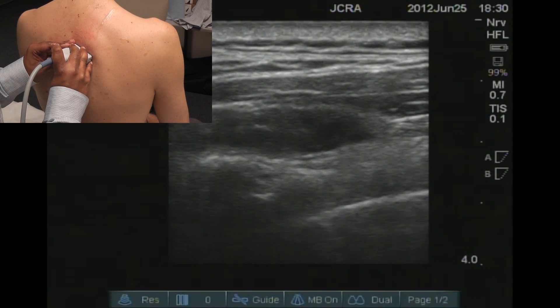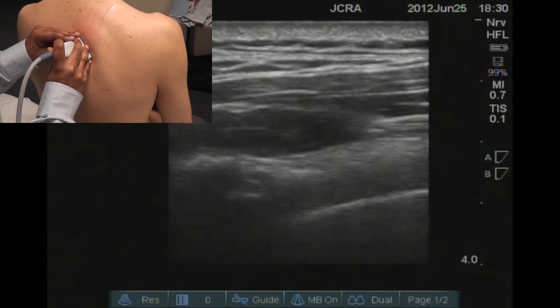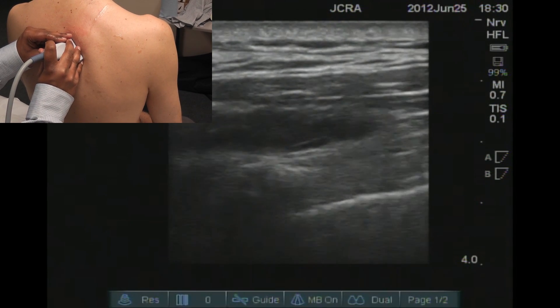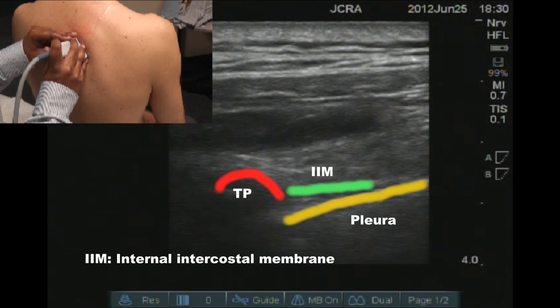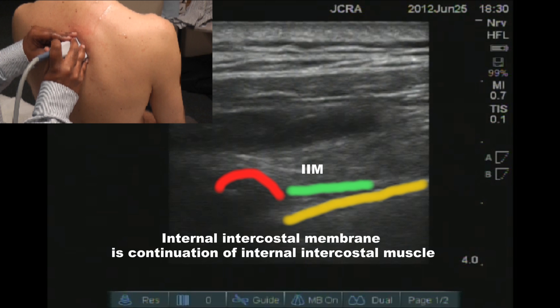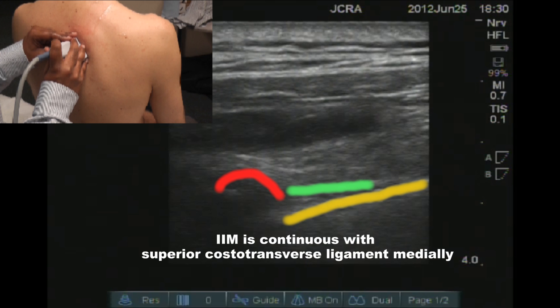This is on the left hand side. If you slightly angulate the probe into an oblique position, you can start seeing the intercostal space — that's where the transverse process ends.